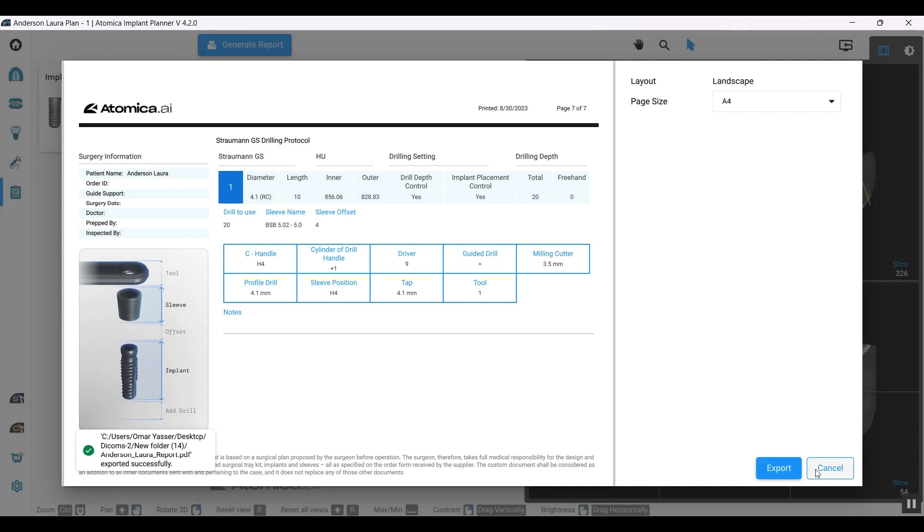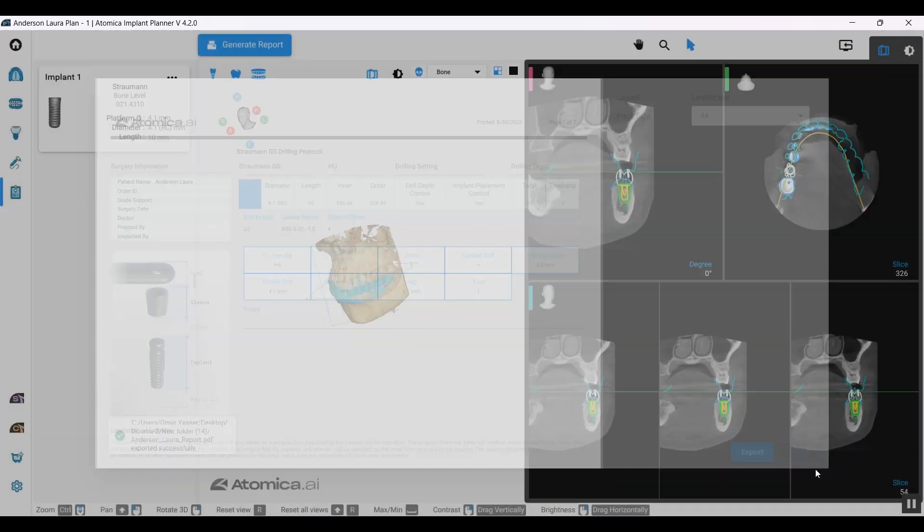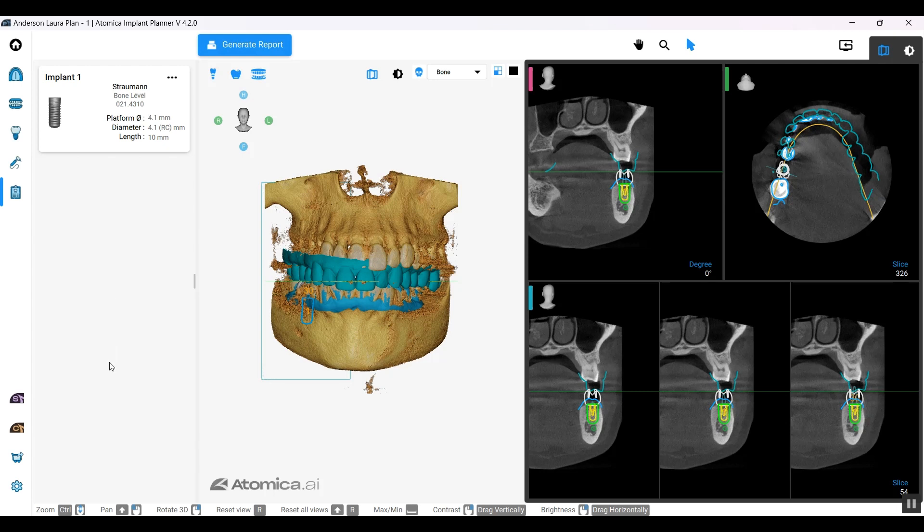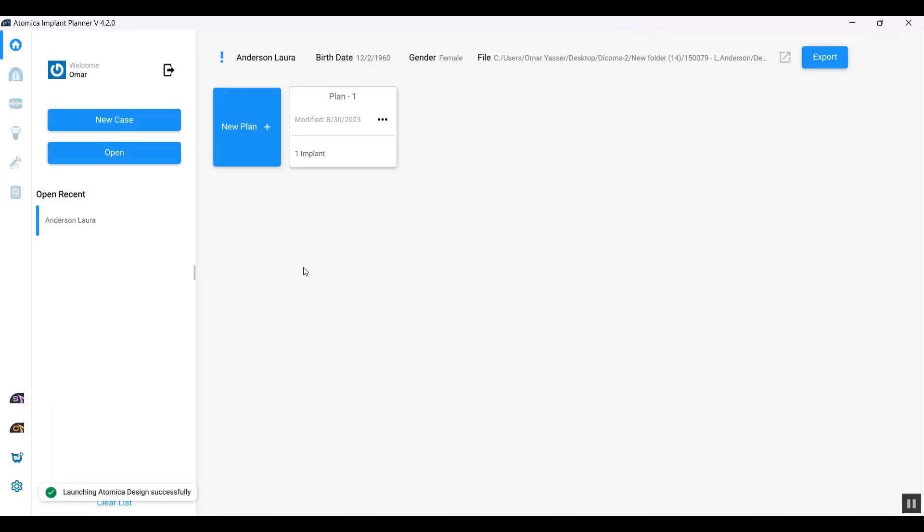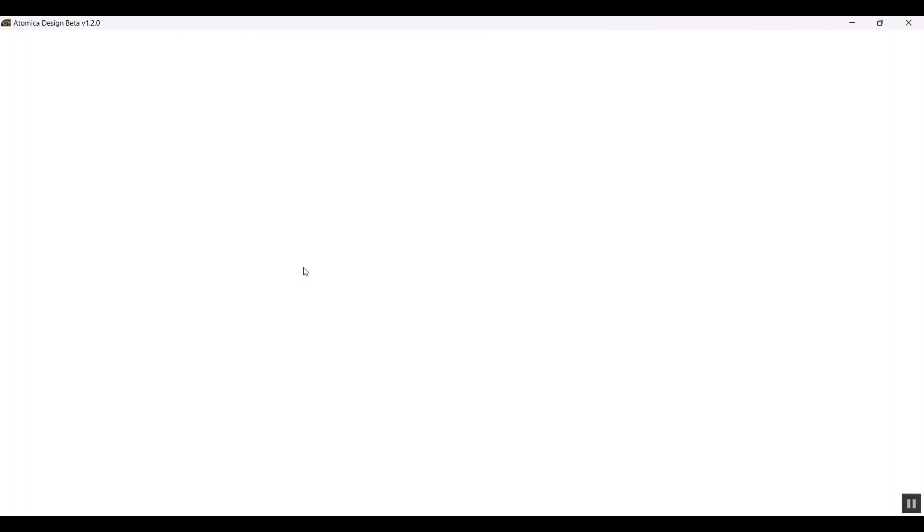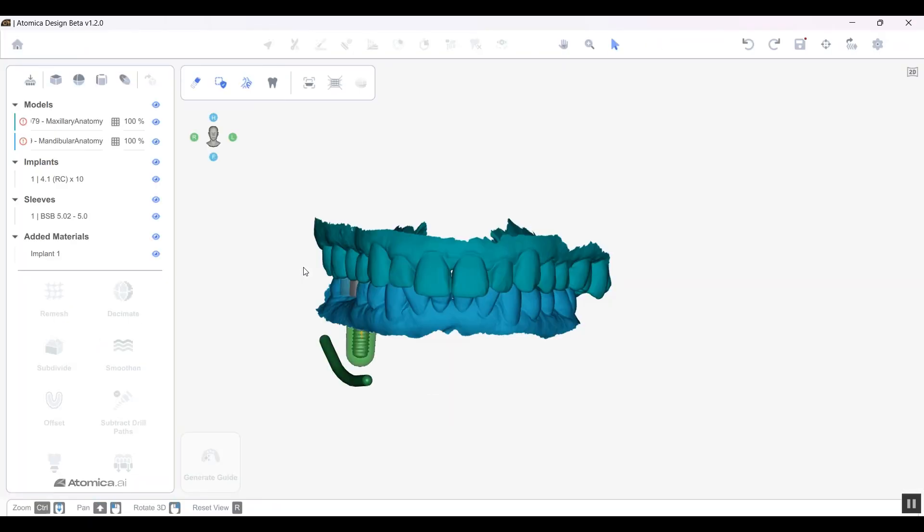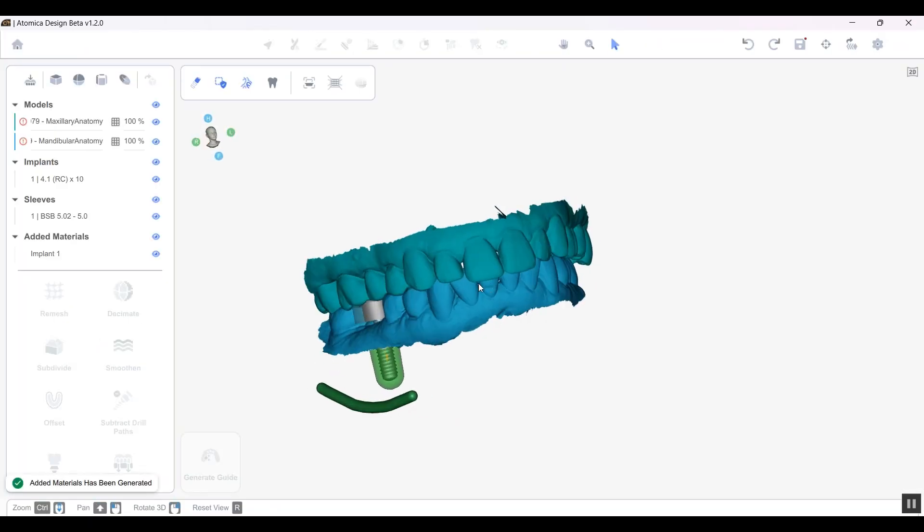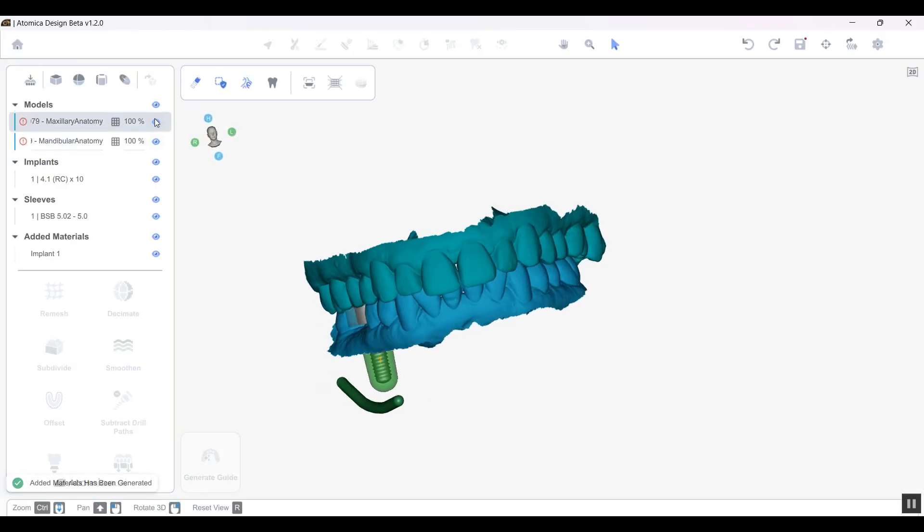Once we're done with planning, let's go ahead and start designing. We're going to launch our Guide Design software right away from here, and it will load my plan immediately.